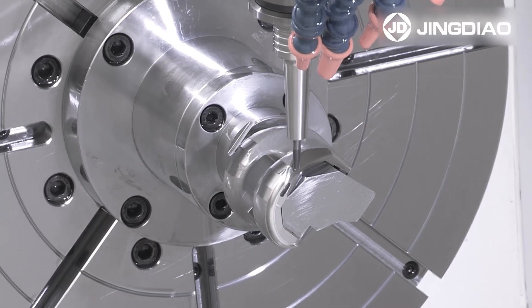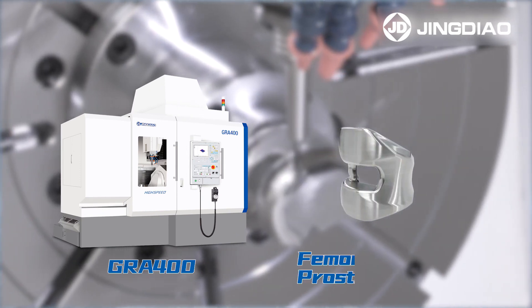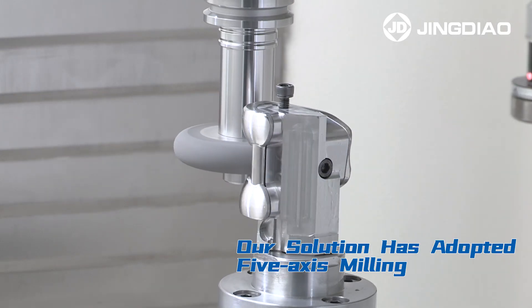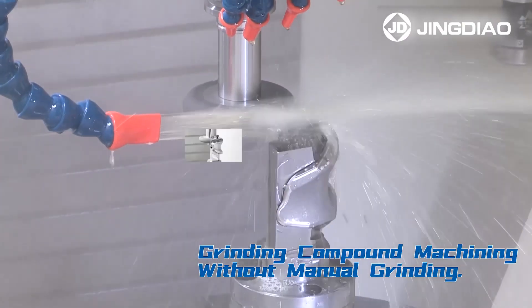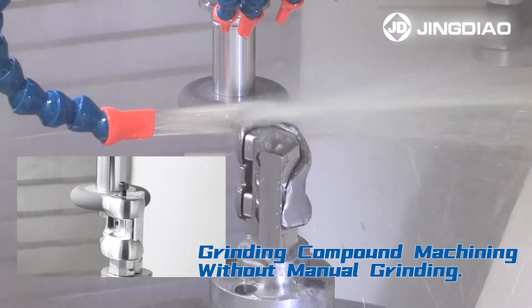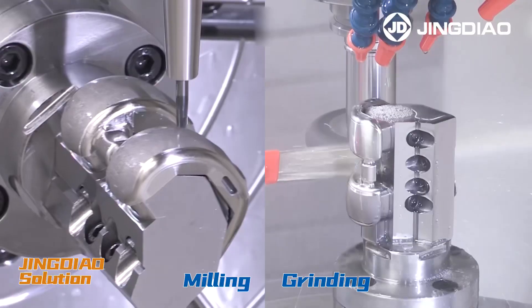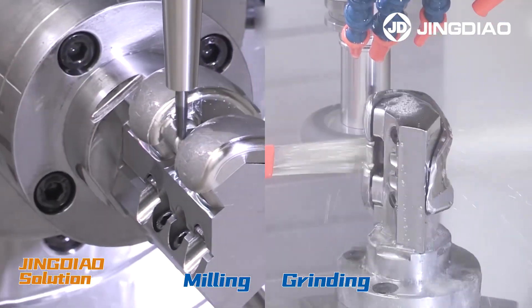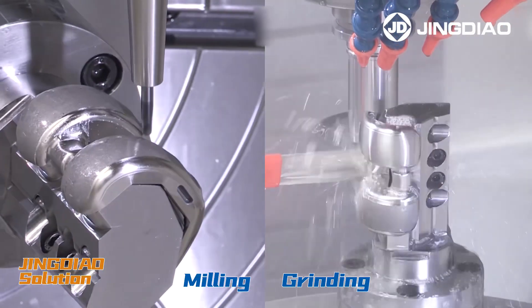Efficient machining solution for femoral condylar processes, presented by JingDiao. Our solution has adopted 5-axis milling and grinding compound machining without manual grinding. The product can be directly put into the polishing machine for fine polishing. JingDiao's JRA400 machining solution successfully achieved both high-efficiency milling and grinding.